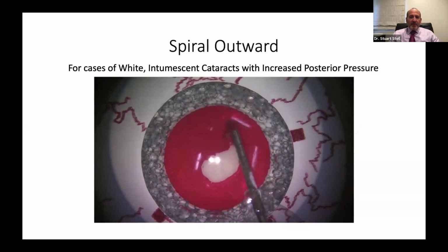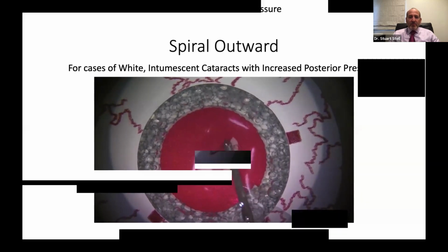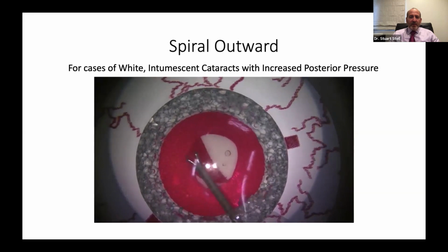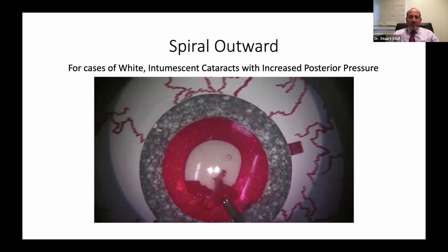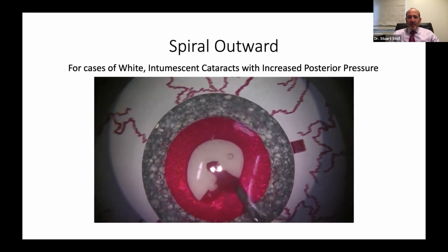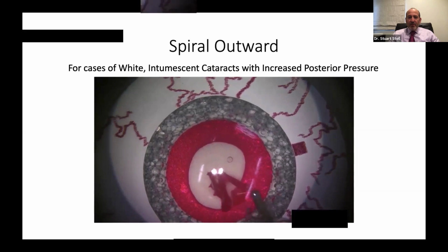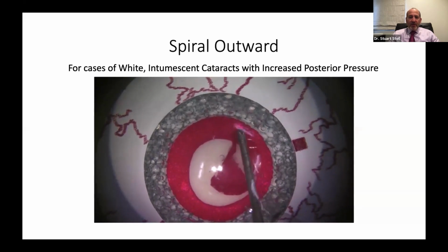But here we are. You can see that we're getting continuously bigger as we go. Immense control, capsule flipped over, tension on, and we're just going to get bigger and bigger as we go here. We're not going to let this capsule run, even though we've dialed up the pressure, and there's a lot of pressure behind this. And you can see we're just getting bigger and bigger, tracing the tips exactly where we want that capsule to go. Fold the flap over, get the tension back on, stay wide now as you want to come around bigger.